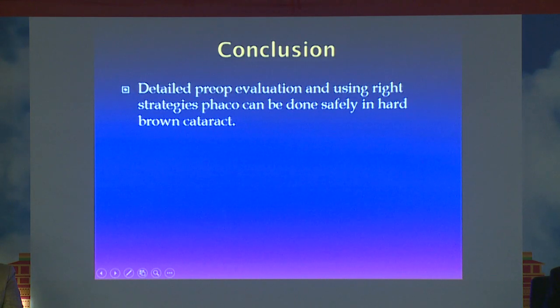So to conclude, a detailed preoperative evaluation: how hard is the cataract, and whether we are comfortable going with the phaco or not, it is a personal choice. And using the right strategy, phaco can be done safely even in a very hard brown cataract.